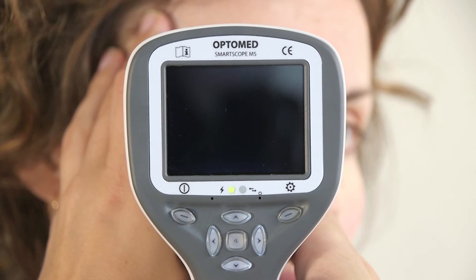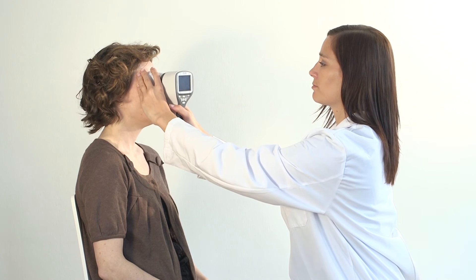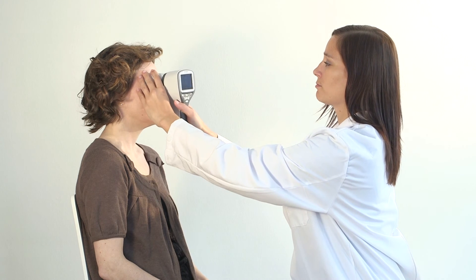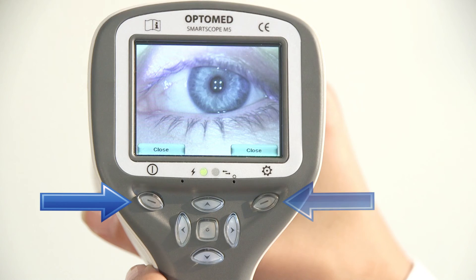Capture image by pressing the shutter button. The patient can be asked to look at different directions depending on what area of the eye needs to be captured. In order to ensure a good quality examination, take multiple images. The taken image is displayed on screen until the user clears the image by pressing the shutter, left, or right soft key.